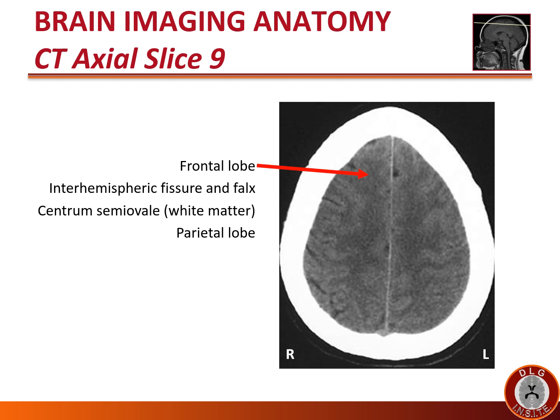At this level, the cerebral cortex anterior to the central sulcus remains the frontal lobe. Between the two hemispheres lie both the interhemispheric fissure — a CSF structure — and the falx — a dural structure. At this level, when we no longer see the lateral ventricles, the deep white matter is called the centrum semiovale, because it is in the central part of the brain and is semi-oval. The parietal lobe makes up the posterior aspect of the brain on this slice, and we remain too rostral to see the occipital lobe.